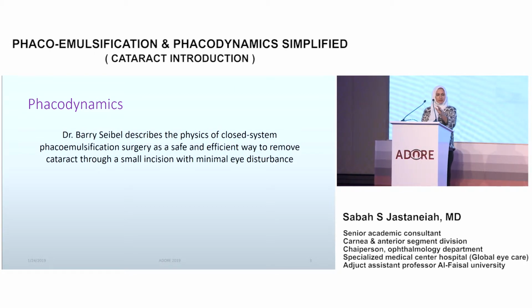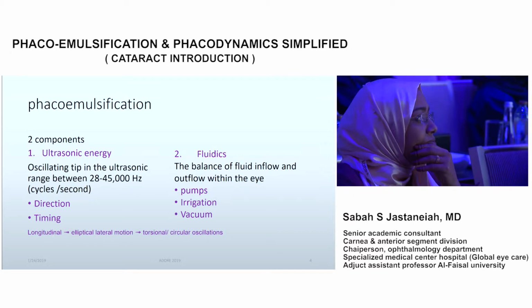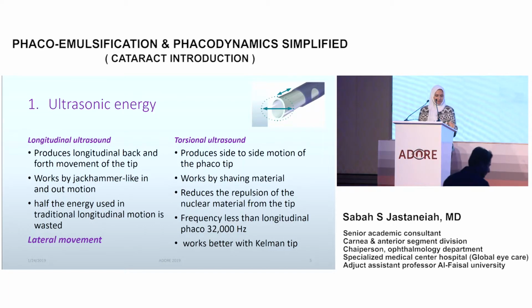So in my presentation today, we're going to talk about that closed system that is going to provide the proper phaco-dynamics for the best result after phacoemulsification. In this presentation, we'll talk about two components of the phaco-dynamics, the ultrasound energy and the fluidics. For the ultrasound energy, which is the basic concept of phacoemulsification, the ultrasonic oscillation of the tip, we will be mentioning a few subtitles of the direction and the timing and the different types of it, and then we will touch on the fluidics.